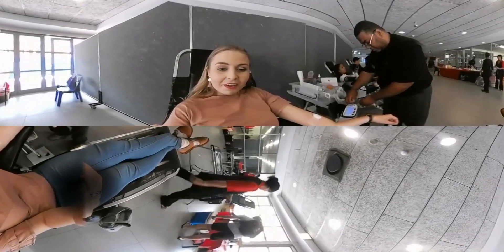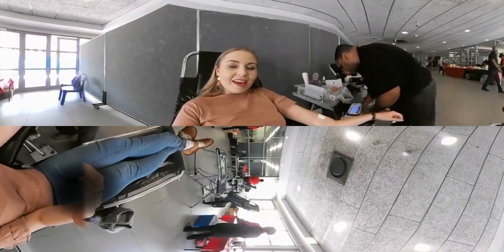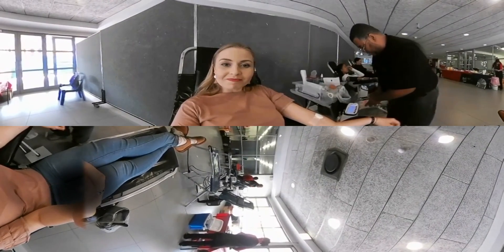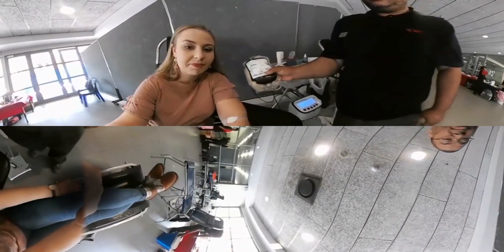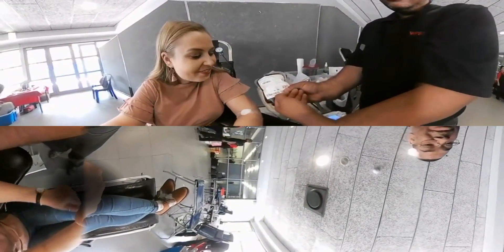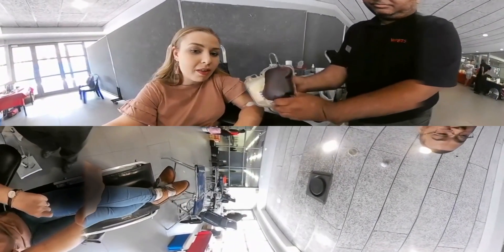That was very simple, very easy, very friendly service. Now I'm going to get a nice juice and biscuit and carry on with my day as usual. This is my blood — goodbye! It's quite warm. It's gone, and at least three to four other people can benefit from it.